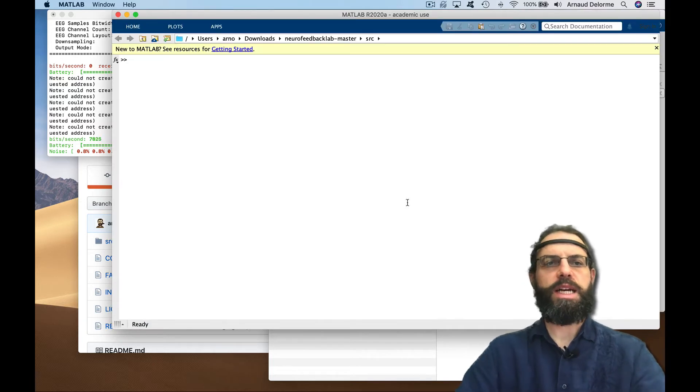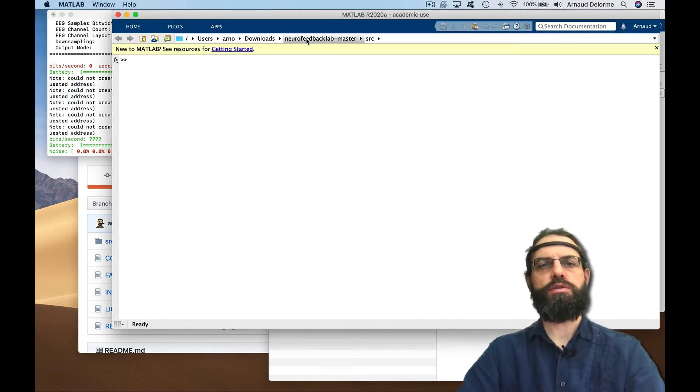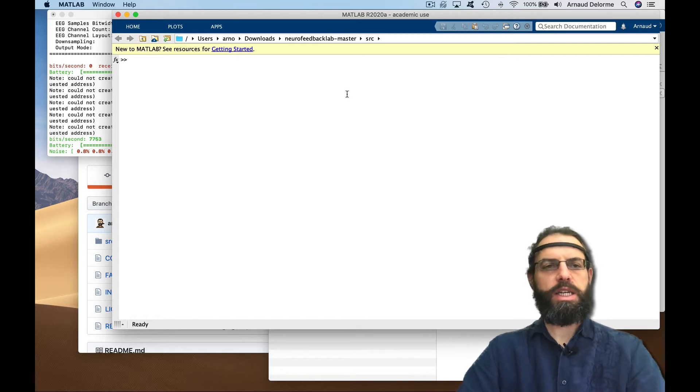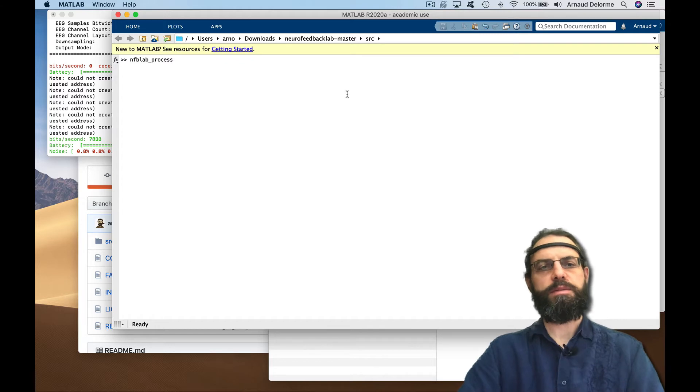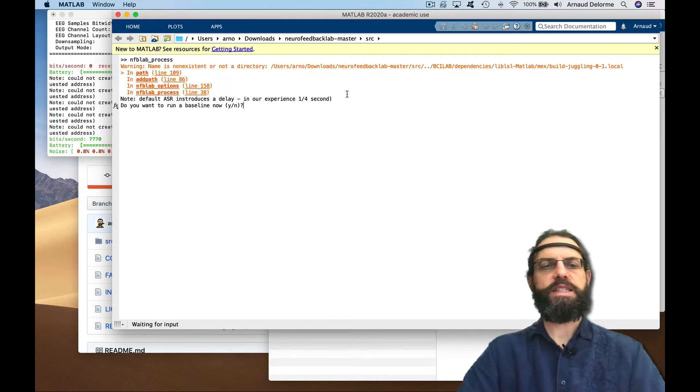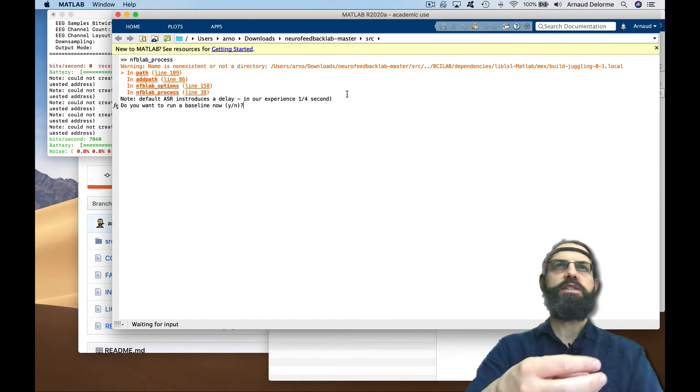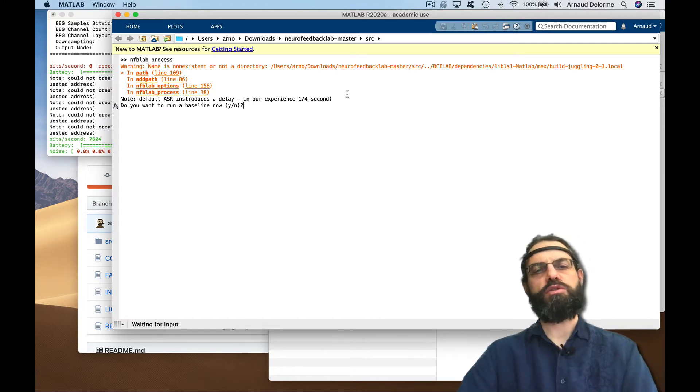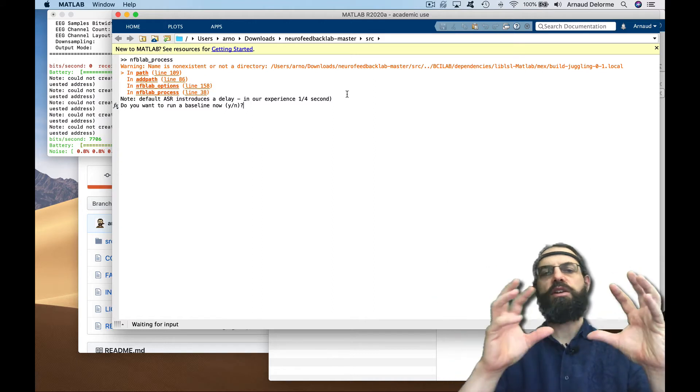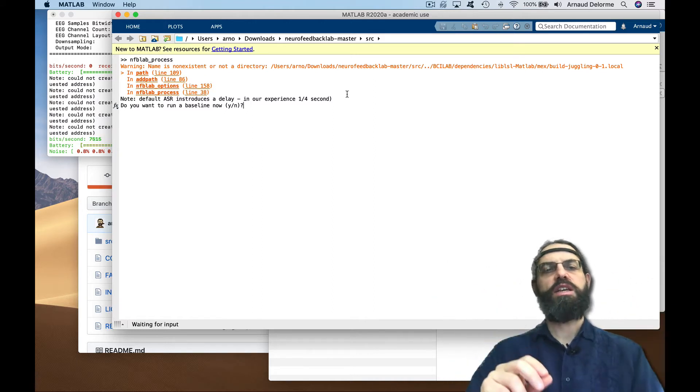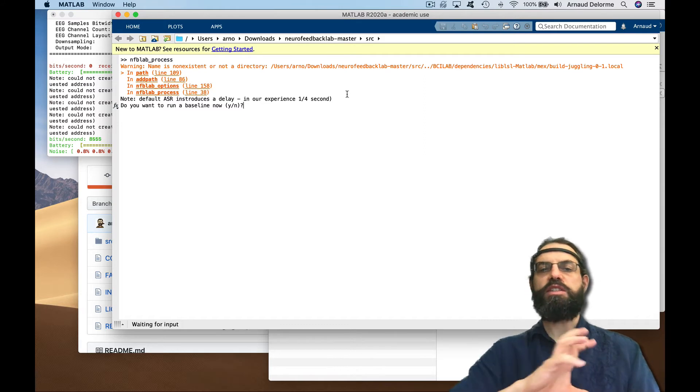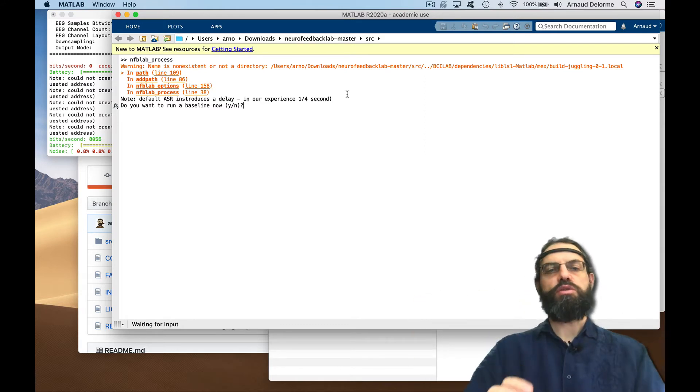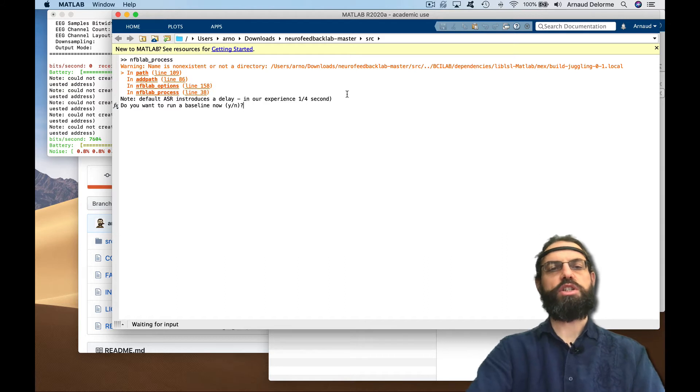I start MATLAB and go to the right folder, neurofeedback lab master sources, and I'm going to type neurofeedback lab process to start the program. You want to record a baseline when you're running ASR, which is Artifact Subspace Reconstruction, a method to correct artifacts, especially movement artifacts. You need to run a baseline, usually about one minute, to get some clean data so it knows what to search when it rejects artifacts.